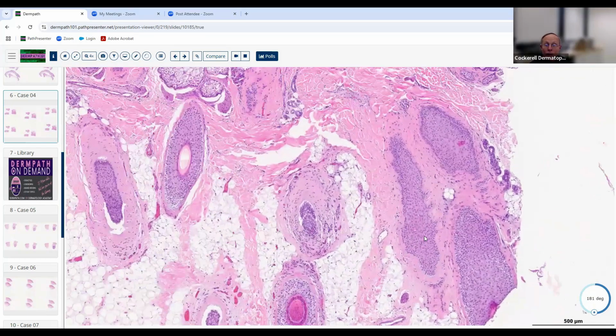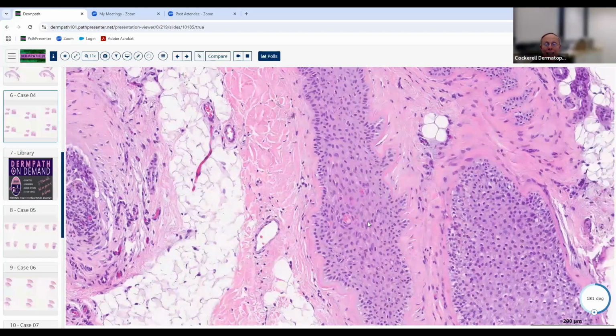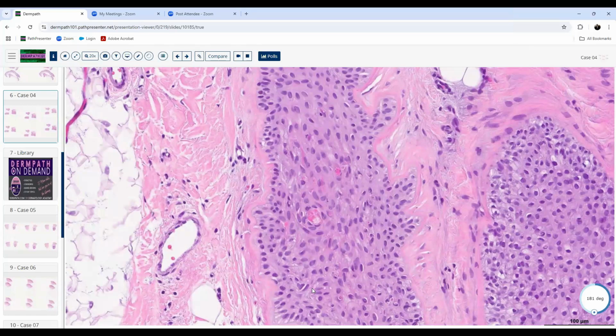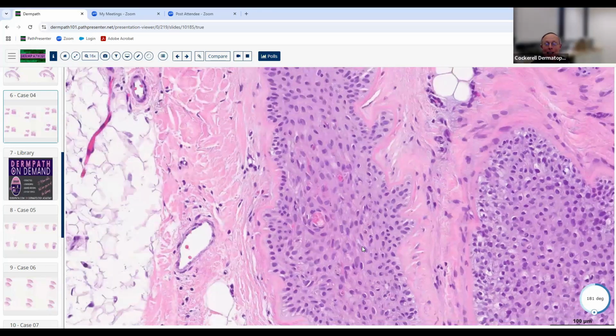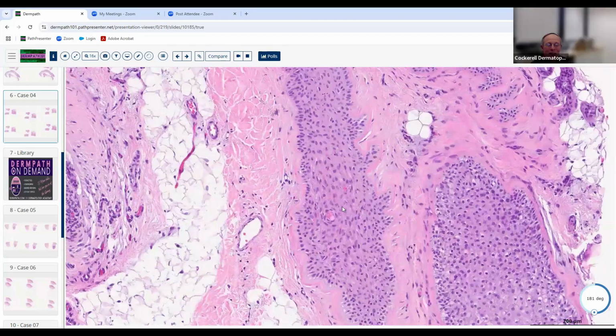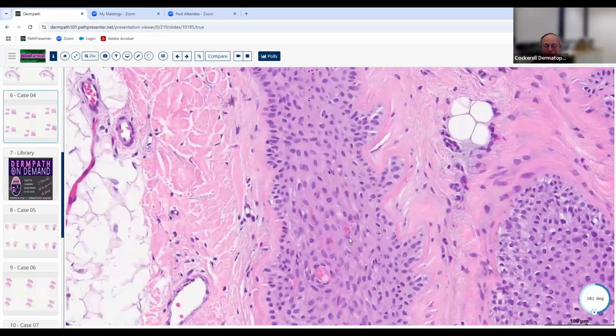Now, what stage of follicle are we looking at right here? High magnification view. This would probably be a dermatopathology board examination question, but I'm asking you, since you zoomed in on the diagnosis so quickly, what stage of the hair follicle are we looking at right here? The center one, I am leaning towards anagen. You had a 1 out of 3 chance. All right, then I will adjust to catagen. Catagen, yes, catagen.